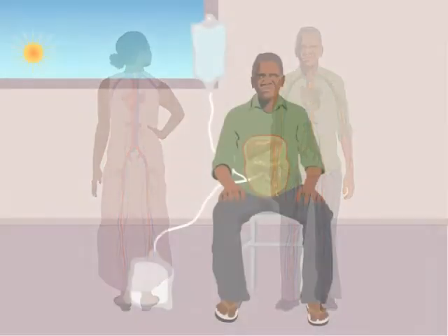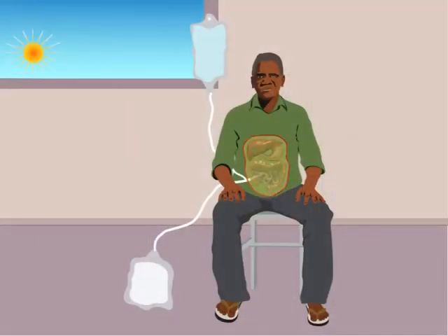This is how you do PD. You have a long soft tube that starts at the peritoneum, comes out from your abdomen, and then connects to two plastic bags. One bag is full, one bag is empty.